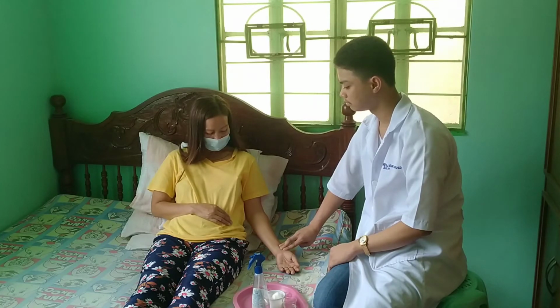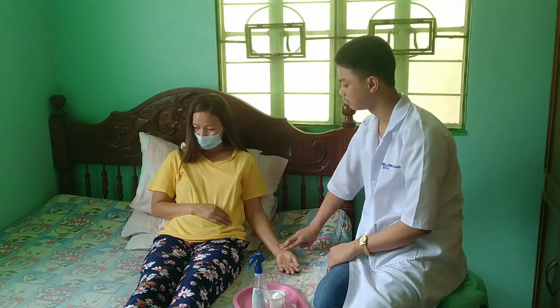When the thermometer beeps, do not pick it up yet and wait until you finish assessing the pulse of the client, because some movements can affect the client's pulse.